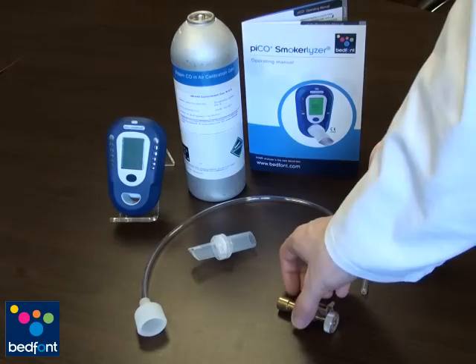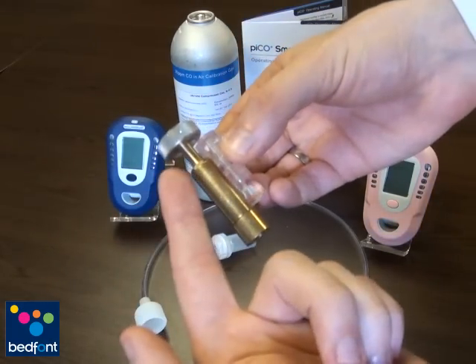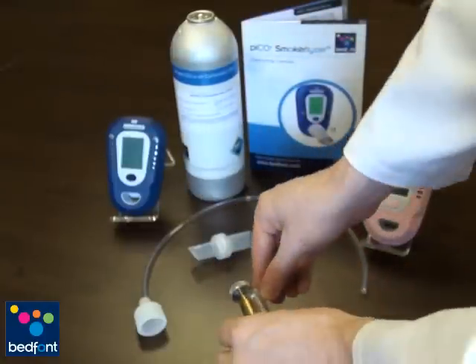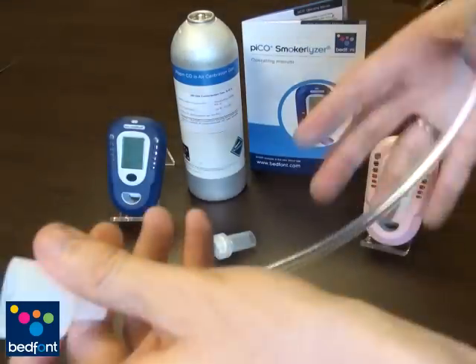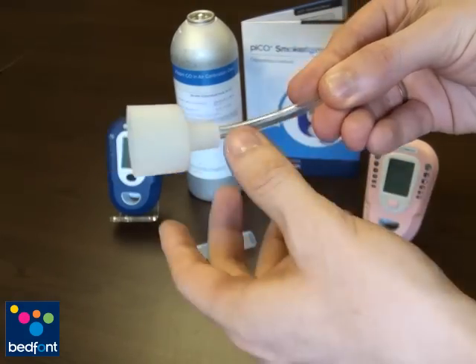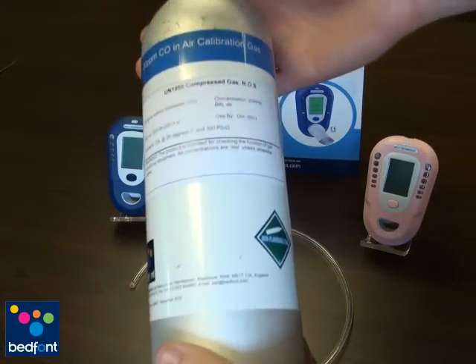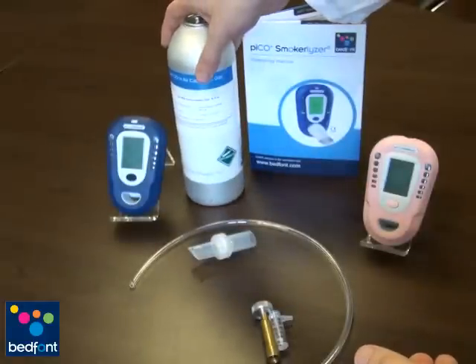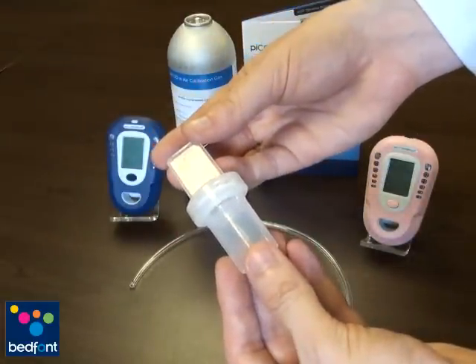In this kit you will find a fine control valve, a flow indicator, a calibration adapter and tubing, and a 20 ppm CO in air gas cylinder. You will also require your supplied D-piece.